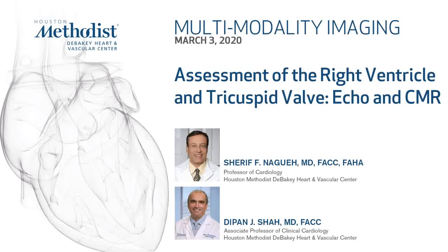Afternoon. Today we talk about the right ventricle, the right atrium, pulmonary pressures, right atrial pressures, tricuspid valve. So the whole right side of the heart, how it is imaged. Sort of easy crowd to preach the importance of the RV to.